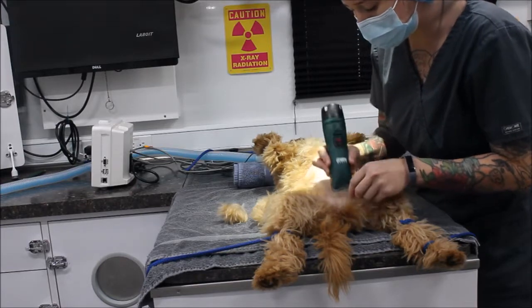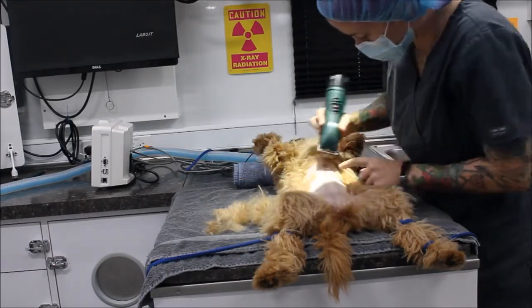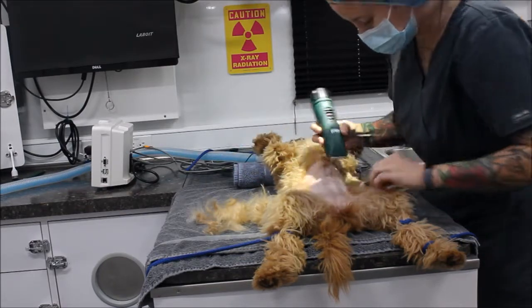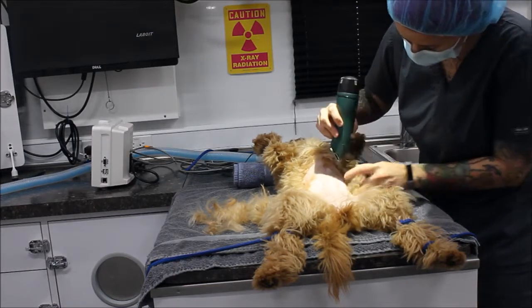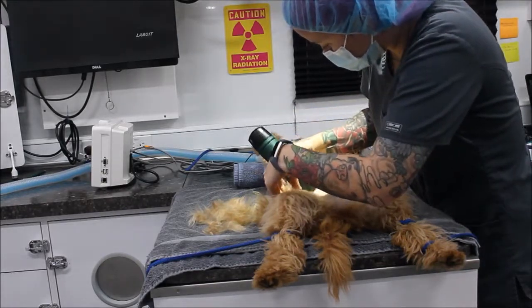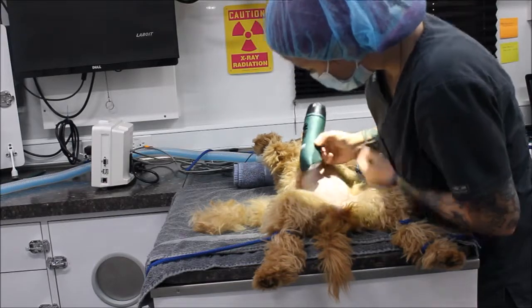With the 40 blade, it gives us a nice clean shave close to the skin. I want to make sure that my lines are nice and straight and clean so it looks good to the owner. Going in the direction of the hair growth to get all the other stray hairs.